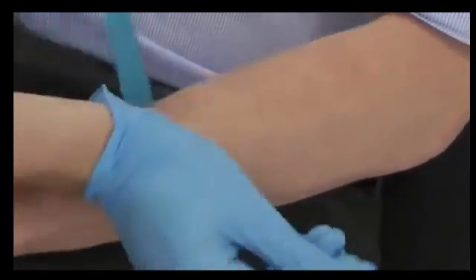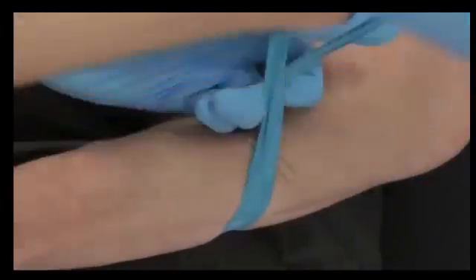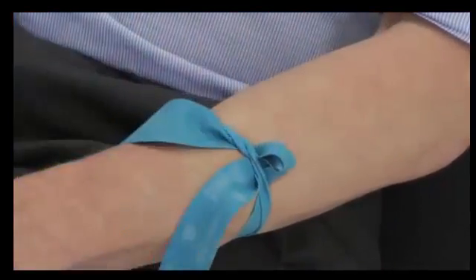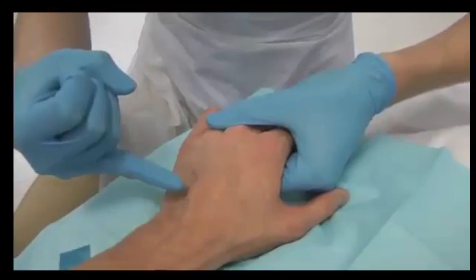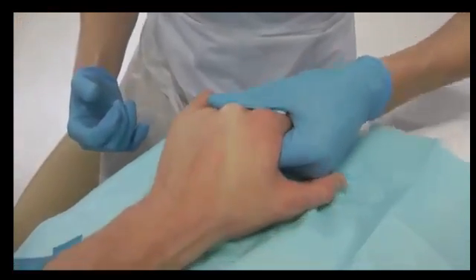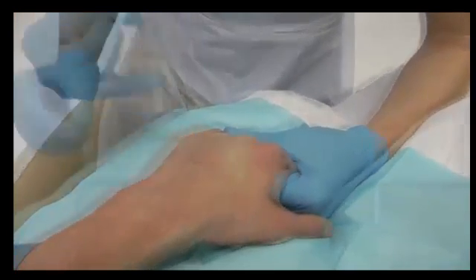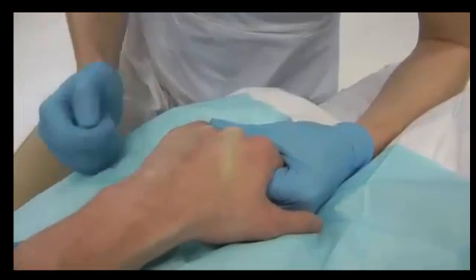The tourniquet is placed approximately 3 to 5 inches above where you plan to insert your cannula. The tourniquet should be tied so that it is easily releasable. Select an appropriate vein — the vein should be as large and as straight as possible. Bend the wrist and pull the skin tight over the knuckle to straighten and anchor the vein. Choose an appropriate entry point.